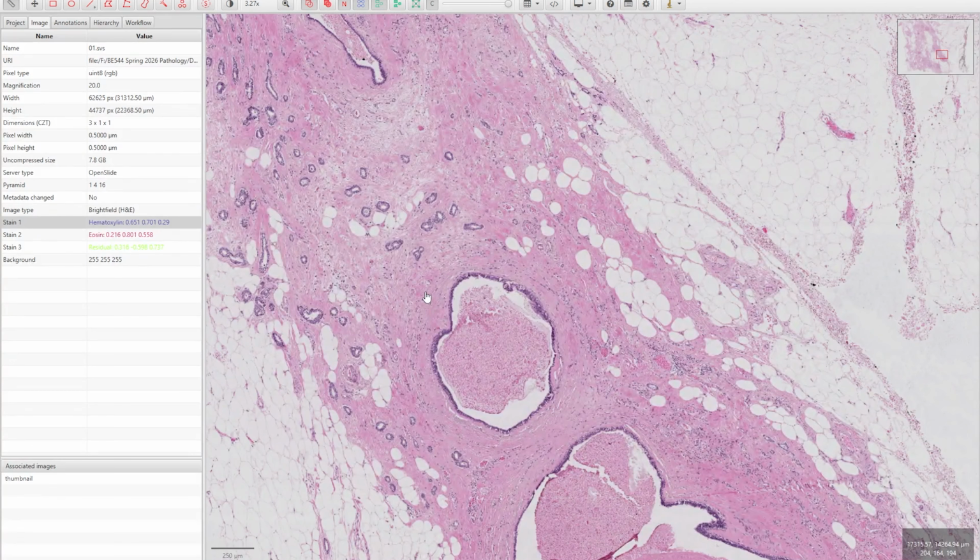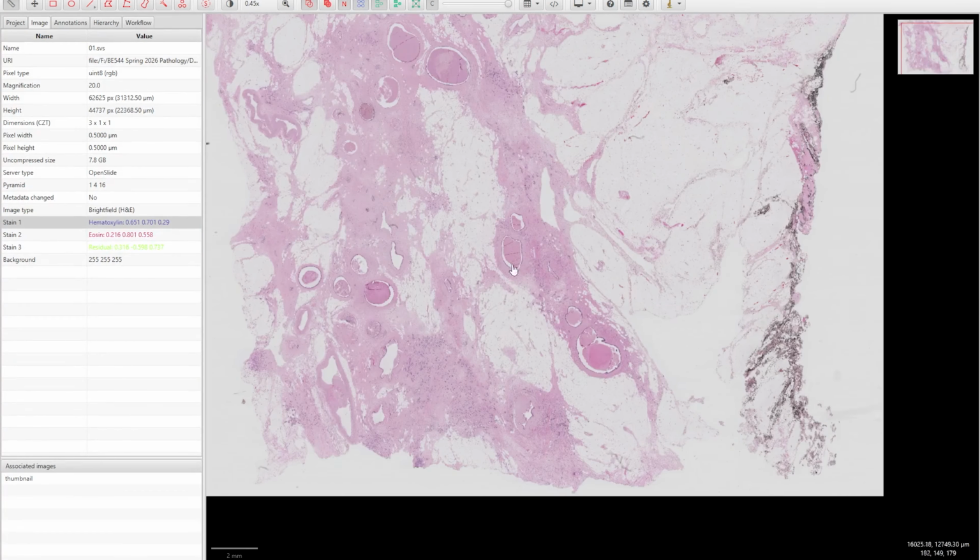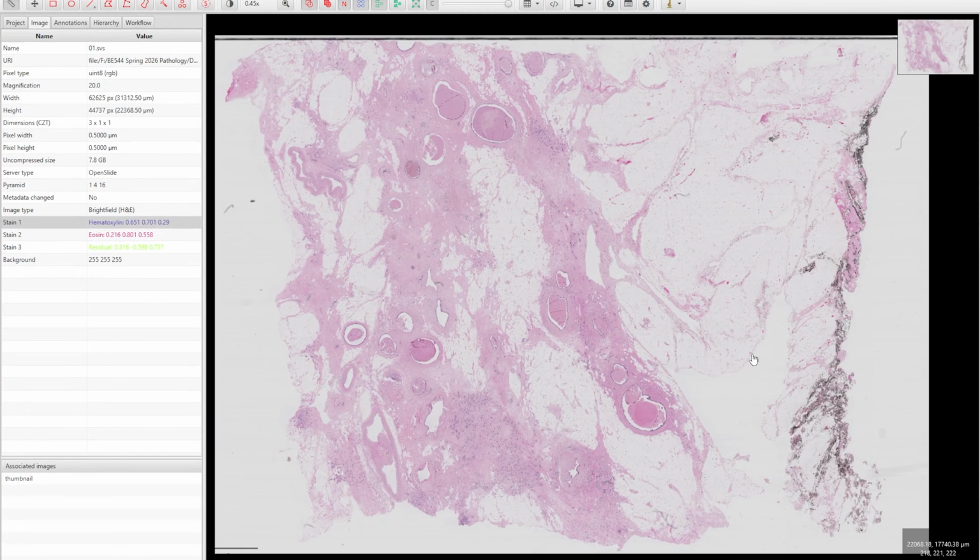Now let's move to the annotation and selection. As you see, this is the abstract view as mentioned, and dealing with the whole slide image is not reasonable because there is background, which is here, there are fats, and if you are dealing with a project that targets specific cells or cells with tumor or cells with malignant or benign tumors, then you need to select these regions and extract them later and work on them specifically.